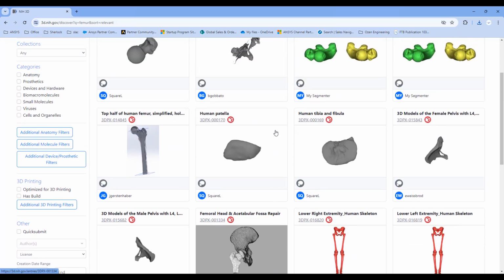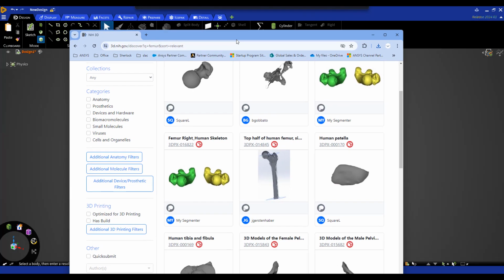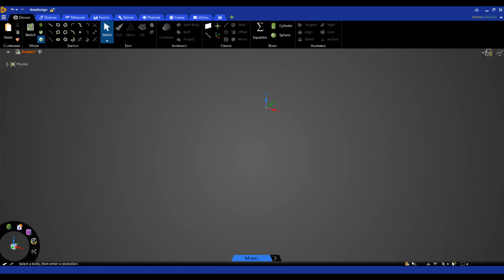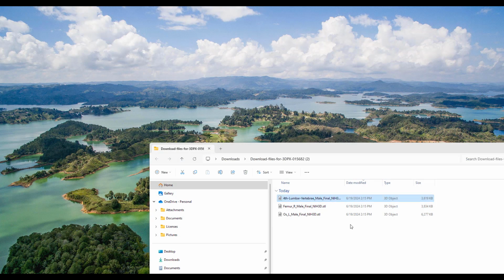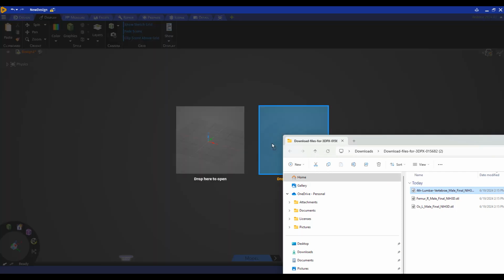The challenge is always, how do we turn this into a CAD model, do analysis, integrate 3D mechanical CAD with these STL components? They're all very high quality, good scans. So I'm going to show you some really easy ways to convert that into actual CAD geometry. So let's try this fourth lumbar.